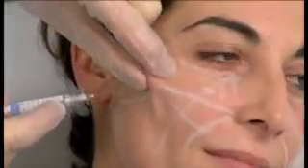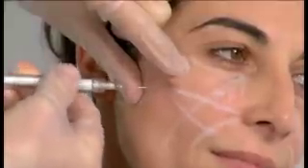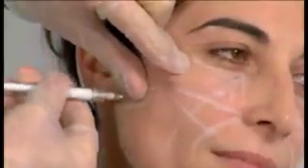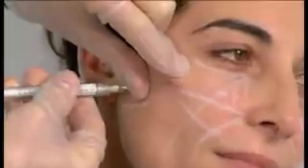Okay, so I've done the stab incision. You want to find your entry point, and you can do that by pinching the skin a little bit. And then to insert the cannula, make a pencil rolling move. You see that I'm struggling because she has quite strong skin in this part. If a patient is used to needles, then it might feel a bit rough for her, but she didn't have any previous injections, so she thinks this is quite normal.